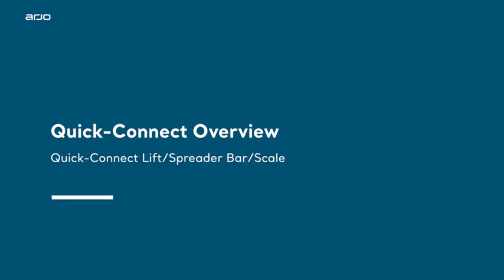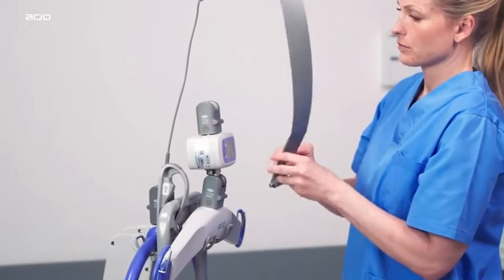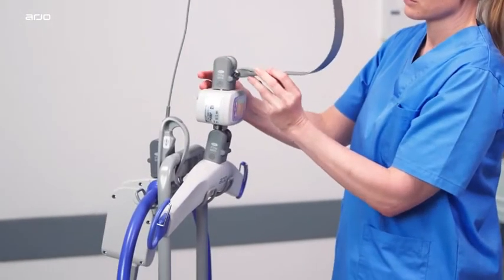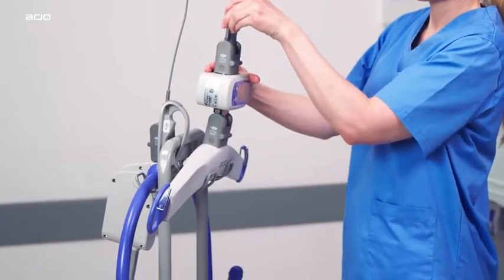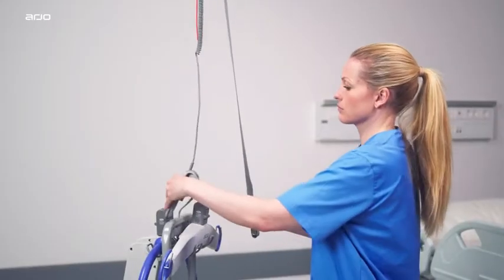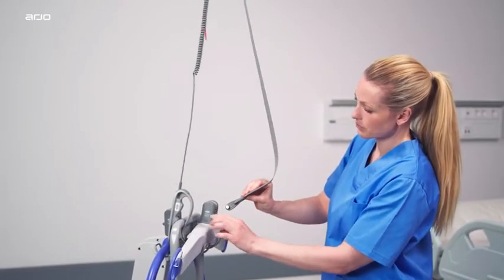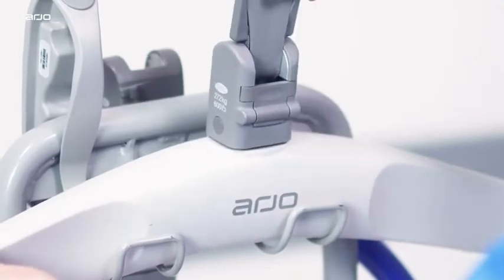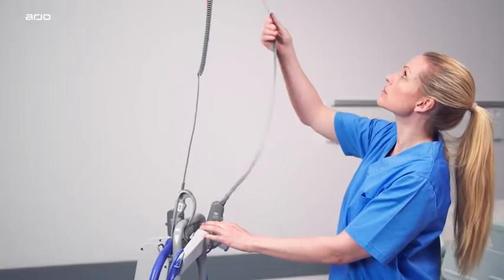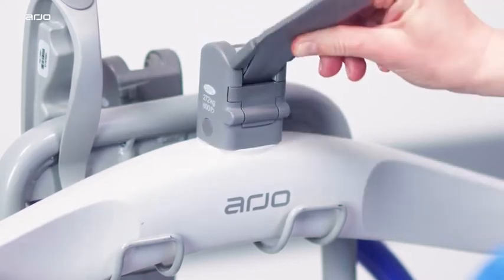Quick Connect Overview. Quick Connect Lift, Spreader Bar, Scale. The spreader bar and scale feature an attachment which allows the caregiver to change it in a few steps without using any tools. Align the spreader bar or scale Quick Connect latch to the hook. Insert the hook into the Quick Connect. Move the spreader bar or scale to engage the hook into the pivot. Make sure that the Quick Connect latch is closed.